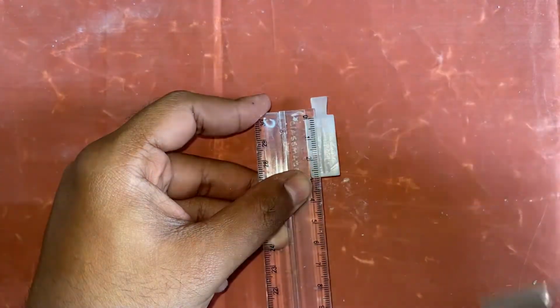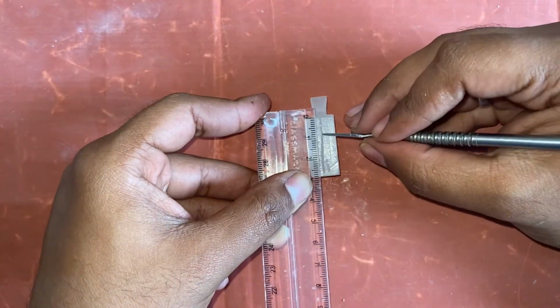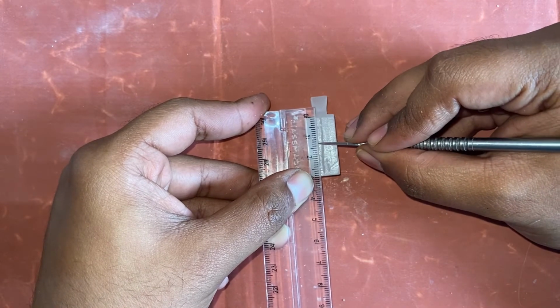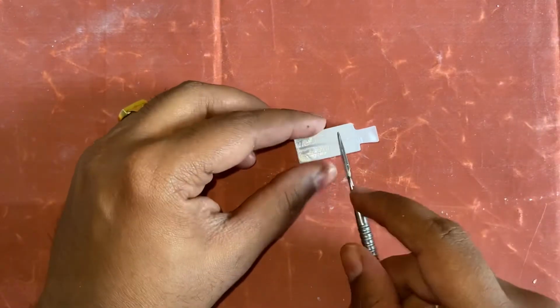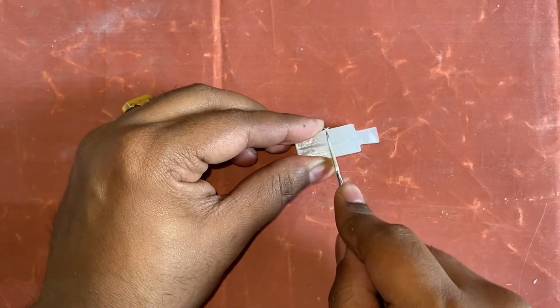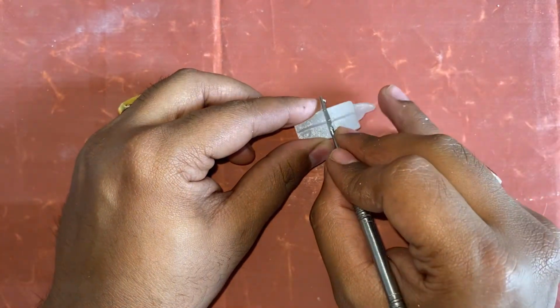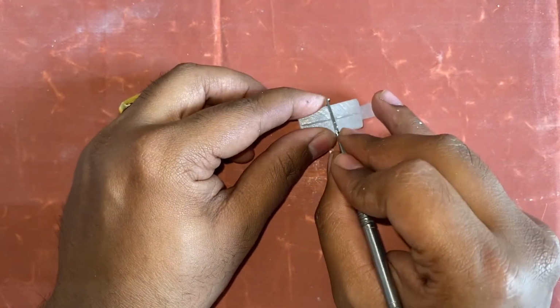So, by using the scale, you have to measure the length of the root. The length of the root for the mandibular central incisor is 12.5 mm. Mark it with the help of a carver and extend the line on all the aspects of the wax block.